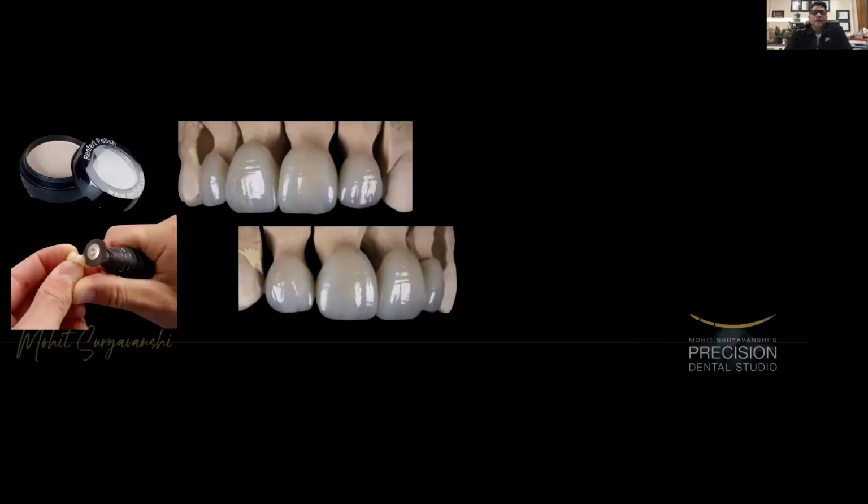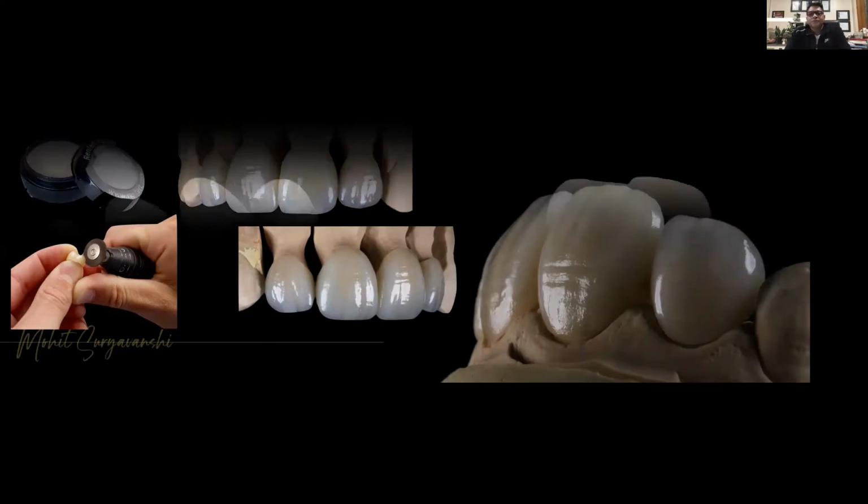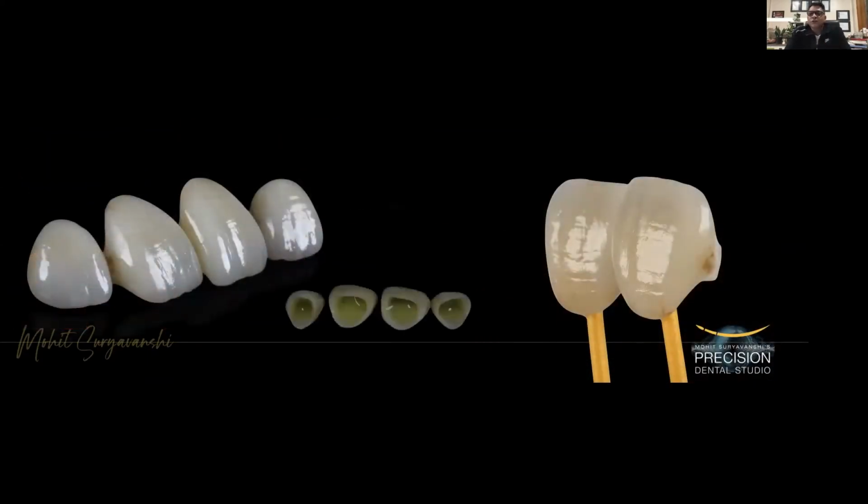And we not only glaze, we also do some mechanical polishing over it, because to maintain the texture, this kind of texture that gives you a very nice light reflection, you cannot do a very high glaze. You need to achieve a satin matte like finish, and that is possible with these diamond polishing pastes. And that's how the case looks, even though it is nicely glazed, but it's not too shiny. It is looking quite lively.